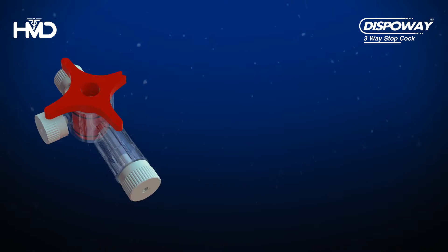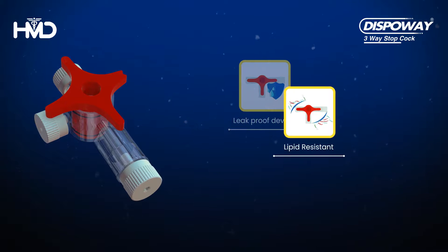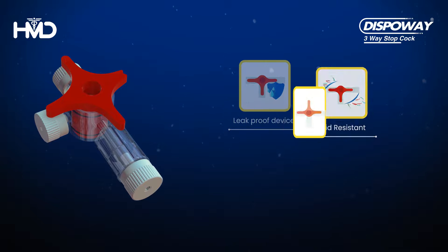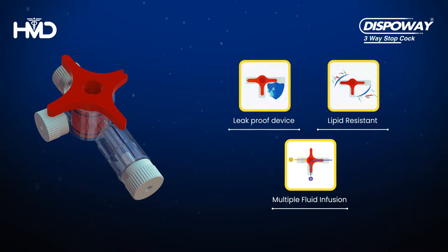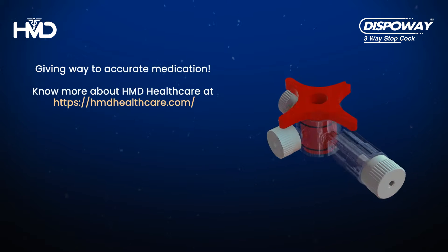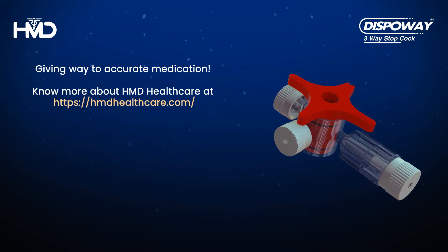DispoWay three-way stopcock is a leak-proof device, is lipid resistant, and it can be used to infuse multiple fluids in a sequence. Know more about HMD Healthcare at HMDHealthcare.com.